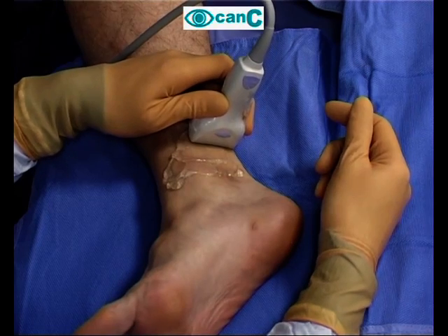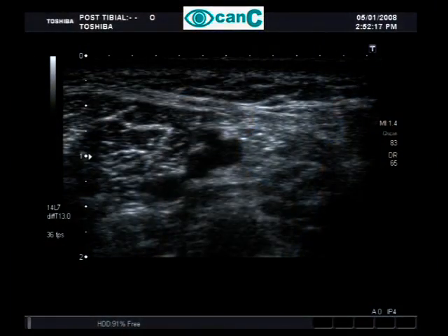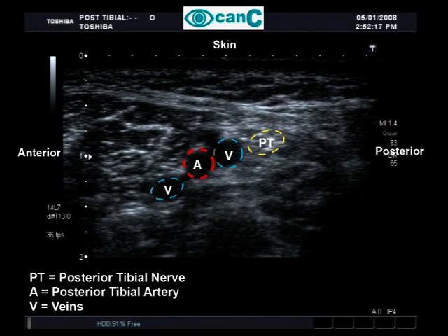For a posterior tibial nerve block, the probe is applied above the medial malleolus. The tibial artery with its concomitant veins can be seen. The nerve lies posterior to the artery and is very superficial.